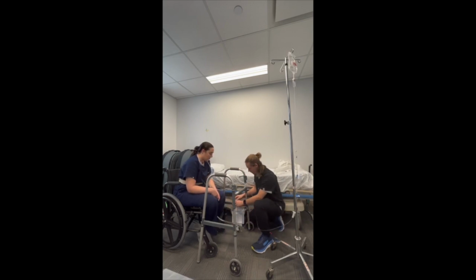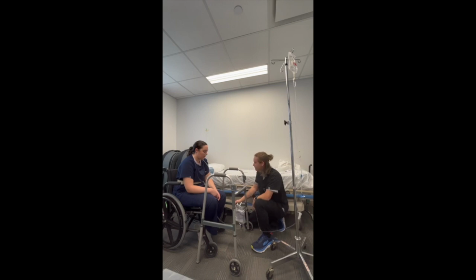So one thing you can do is you want to make sure you take up some of this slack, and we can clip it in all together, or often these will have ties or other clips that you can use to wrap it around and create something that's going to hold it in place. Make sure that they have enough slack that it's not going to pull out when they move the walker a little bit, but that there's nothing there that's going to trip them.